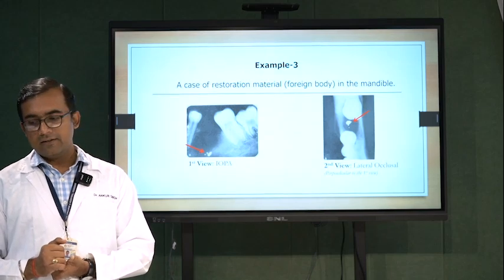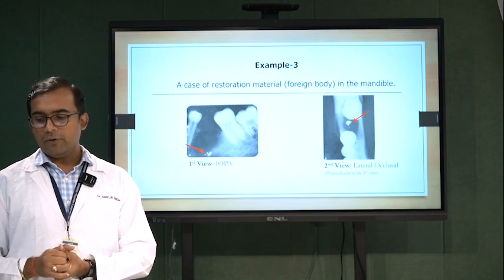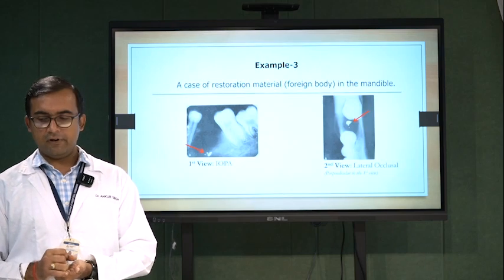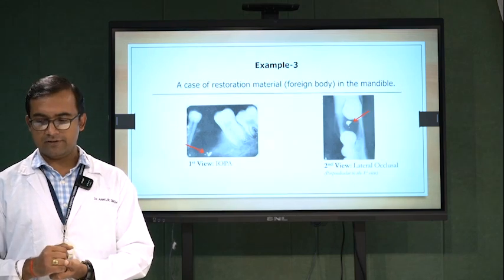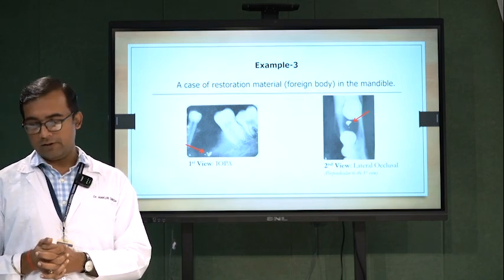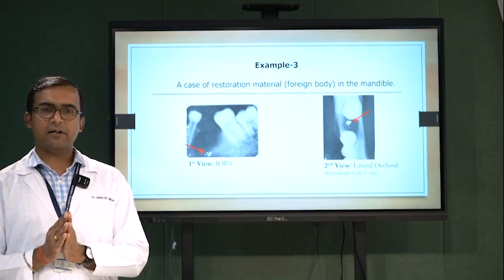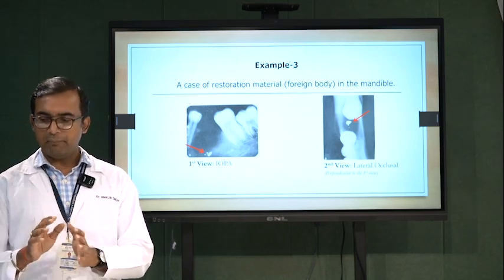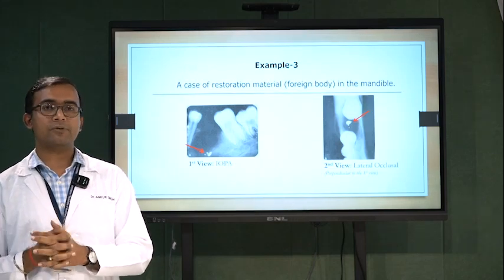The 4/6 is extracted. Periapical to that, we can see some opacity. Now in the IOPA, it is always difficult to find the depth of the lesion or the object. So the cross-sectional occlusal or the lateral occlusal shows that the object or the filling material is present immediately just periapical to the 4/6, or exactly in the same location of the 4/6.